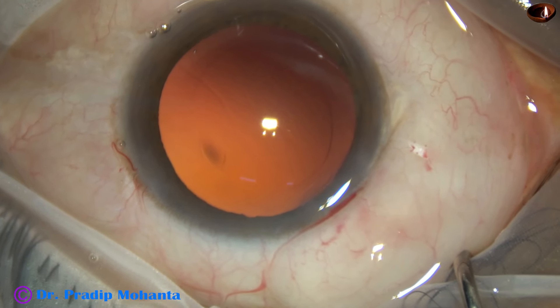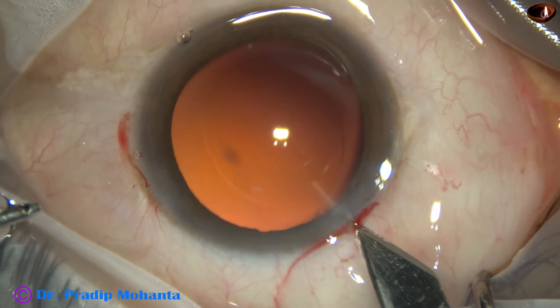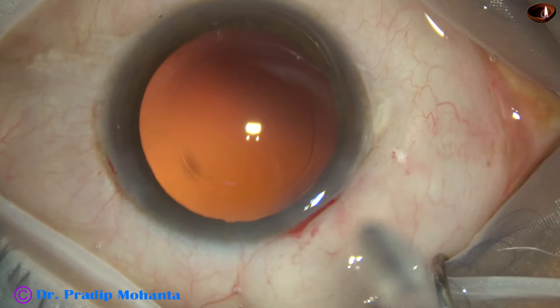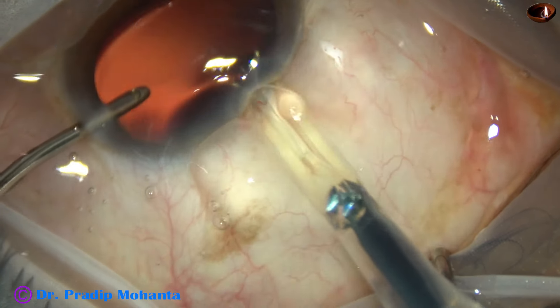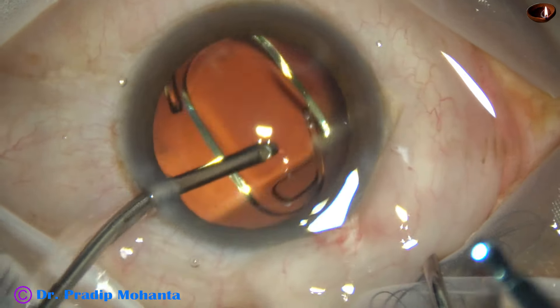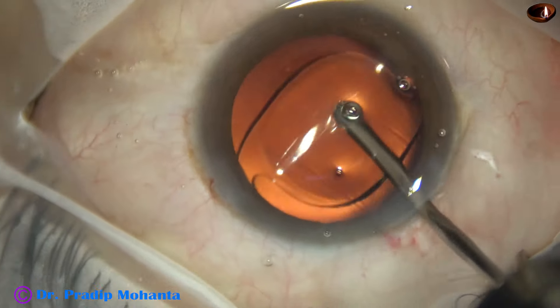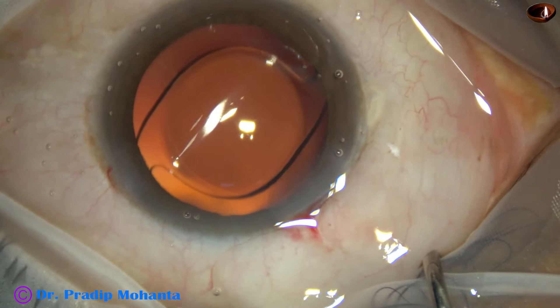Now it is time to implant an intraocular lens. The main wound is enlarged a little bit because I am using a B-cartridge. Wound-assisted delivery is a bit tricky because the lens can get stuck in the wound. The intraocular lens has been placed in the capsular bag. Some more irrigation is done to remove the visco molecules that were in the lumen of the cartridge.